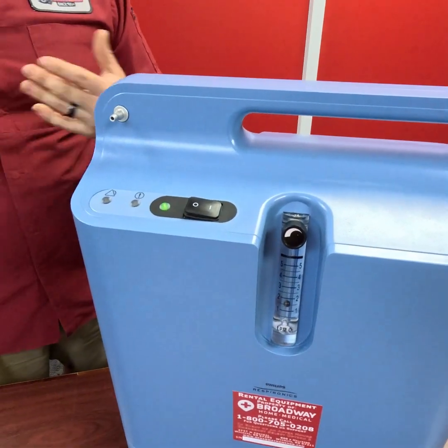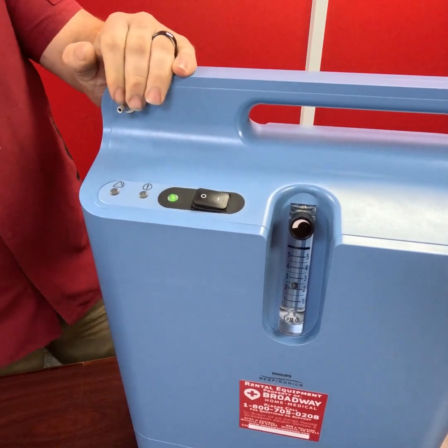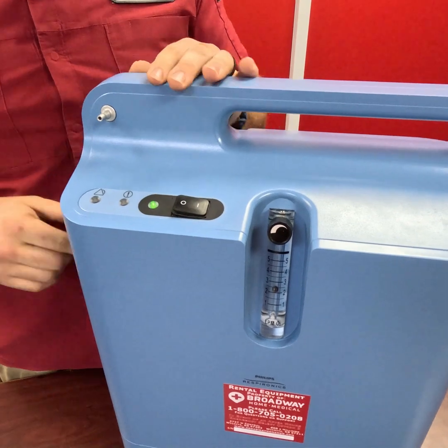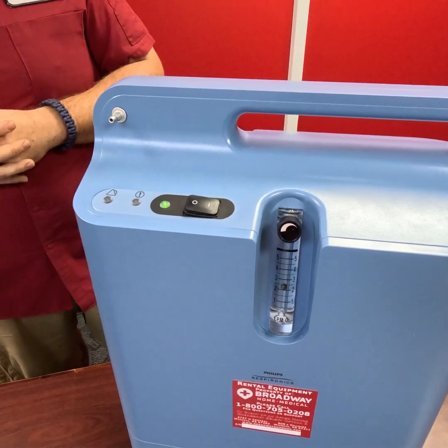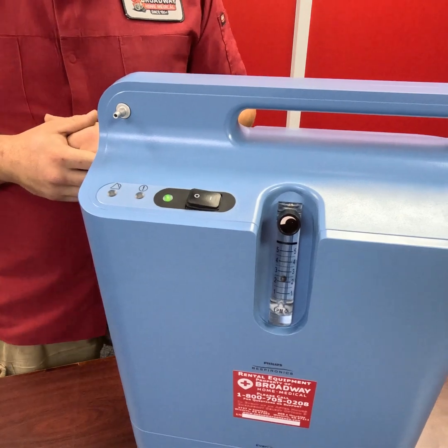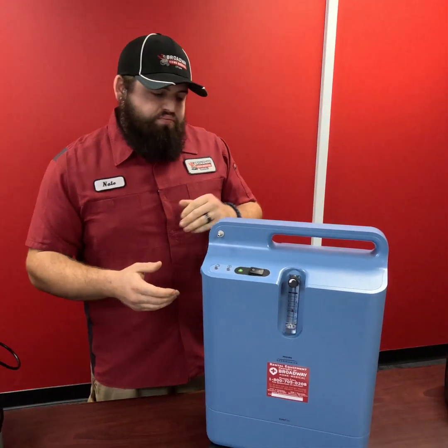Most concentrators, when you first turn it on, will give you that beep, and all of the lights up here will light up. Green lights are always good. If you do ever see an orange light or a red light, it is typically reason to contact your oxygen provider, that way we can get out to you and get you some help.